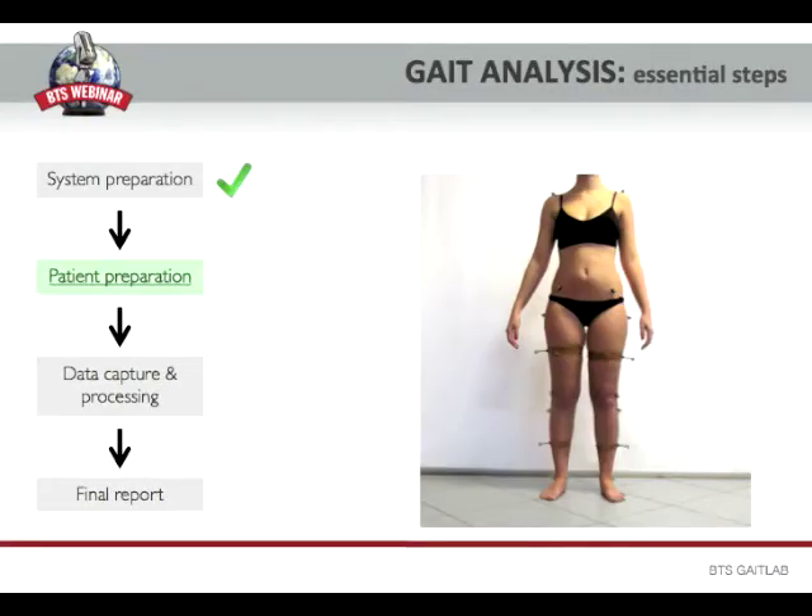The preparation of the patient is a very important phase, because on the basis of the care with which we apply the markers on the patient, we will read more or less accurate data in the clinical report. During this lesson, I try to give you all the useful advice in order to make the marker placement absolutely precise.